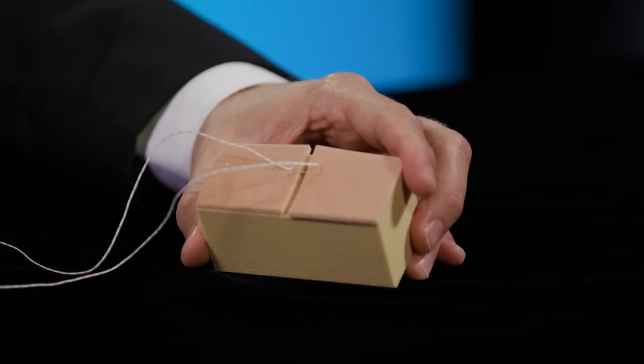You can continue to pass sutures for subsequent closure until you're happy with the amount of closure you've achieved.